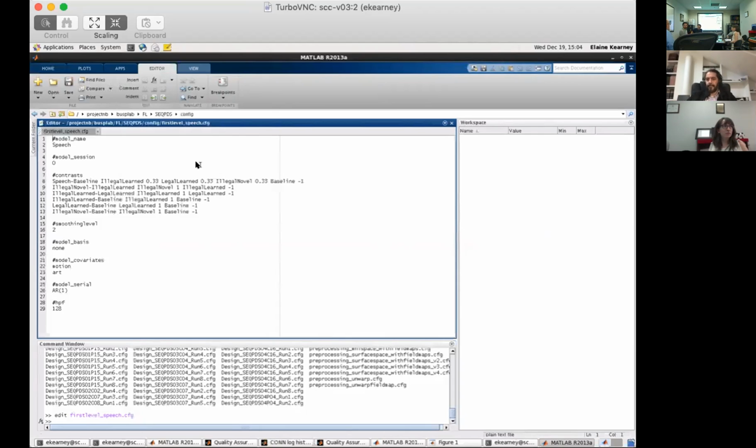But yeah, if there is duration, you could have the duration for every... Right, and then you have something different like duration, which is a single number per trial, which might be a combination of multiple acquisitions, depending on your design, or it might be just one single acquisition, in which case it will be exactly equivalent to this type of model covariates. But if you have individual trials, like an event-related design, and you have numbers per event, then those are another sort of covariates, and in SPM lingo, those are called parametric modulators, and you enter them here also as parametric modulators.